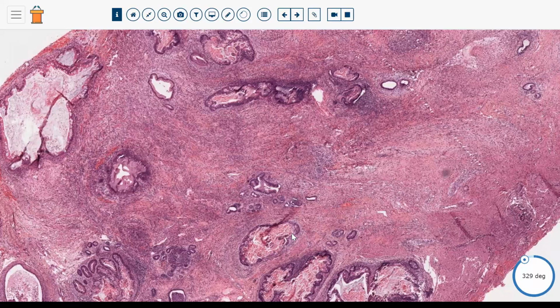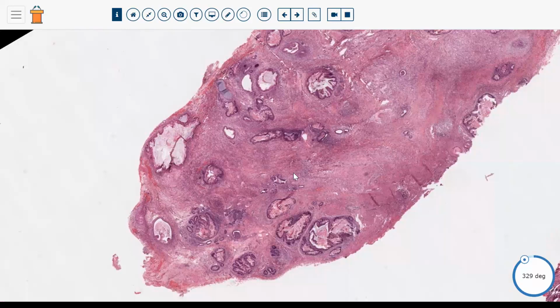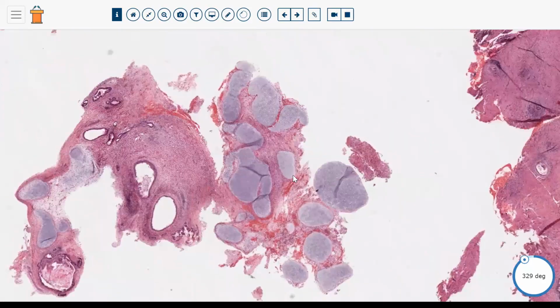Those are the most common types of prepubertal type teratomas that you could see in an adult patient. But rarely you can have other types of glandular epithelium as well, for example, respiratory type glandular tissue. But again, any atypia, haphazard architecture, GCNIS, or any of those things that I mentioned would argue against a prepubertal type of teratoma.